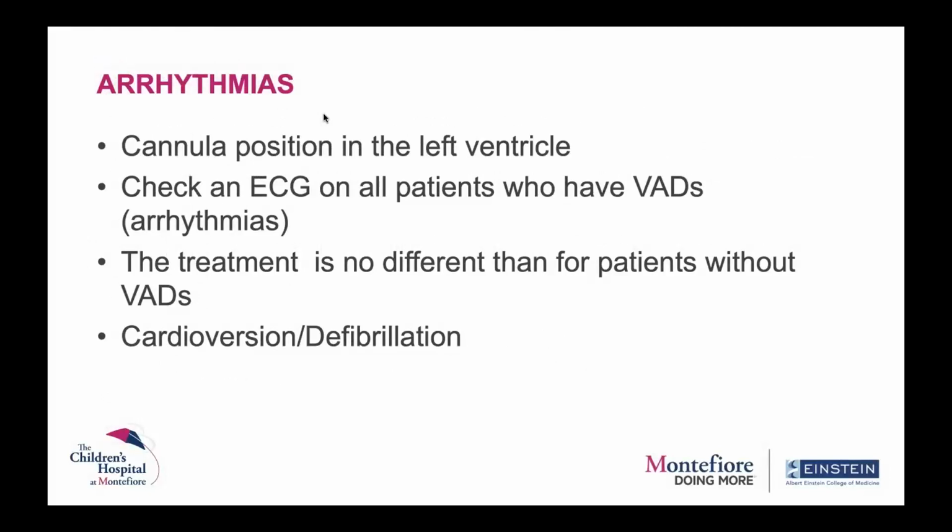Patients are also at risk for arrhythmias, as you can imagine, since these patients have a cannula sitting in their left ventricle. That can tickle the heart and cause various abnormal rhythms. The treatment for these abnormal rhythms is no different than in patients who don't have VADs. And you can also cardiovert or defibrillate these patients, using those pads and giving them a shock, but obviously it comes with its own set of risks.